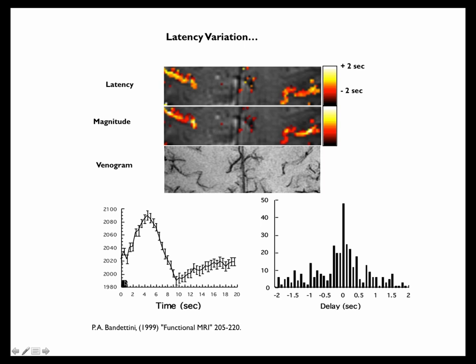So you can give all the way down to, like I mentioned, 500 milliseconds. This happened to be a 1 second stimulus. What we did here is sort of a poor man's way of measuring latency. You took this curve and you shifted it along and found the maximum correlation at where this curve was shifted. AFNI can do this pretty easily. And then map out whatever that shift was that optimized that latency and that optimized that correlation. And so that's how we made this map right here.